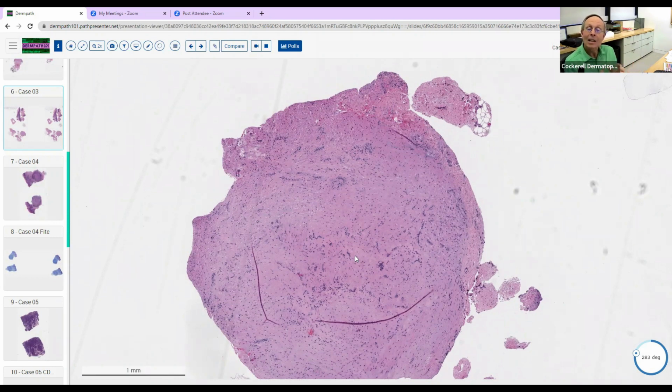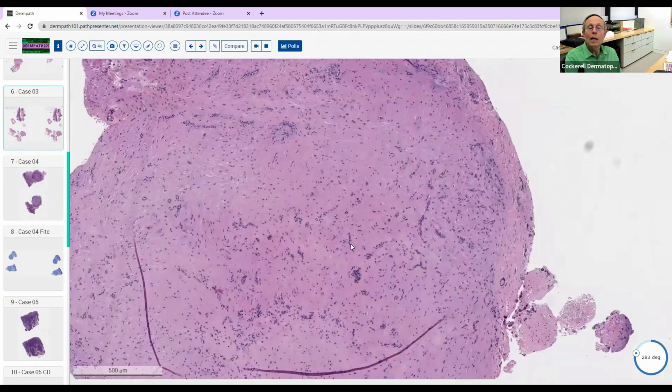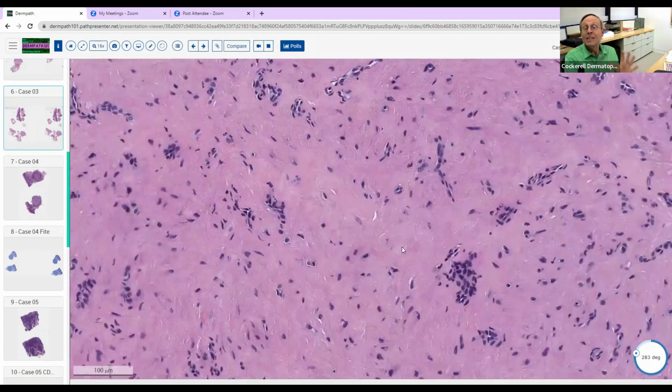It's kind of analogous in some ways, not exactly, but it's sort of in the family, if you will, of things like morphea and scleroderma, where the main problem is too much sclerotic collagen versus things where there's atrophy or a lot of inflammation. So here you've got an overgrowth of these fibroblasts that produce too much collagen and then lead to contracture deformities and things of that nature. So just remember, this is in the differential diagnosis. This is what this is here.